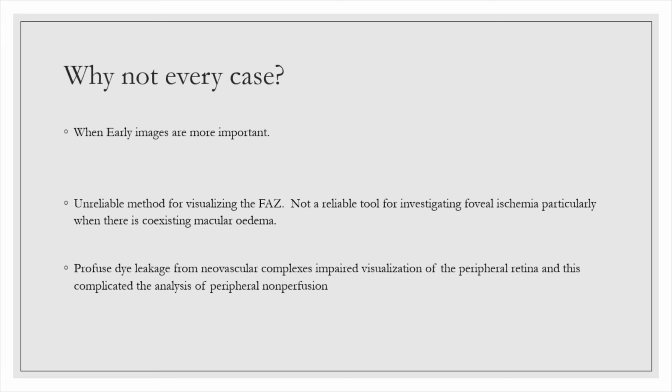So if it is so beneficial, then why not every case? Because it does not capture early images. The phases that are described in the IV angiogram are not so well delineated on the oral, and this method is unreliable in visualizing the FAZ. It cannot investigate foveal ischemia, particularly if there is macular edema, and in the presence of NVD or NVE, there is profuse leakage, and so CNP areas cannot be identified very clearly.